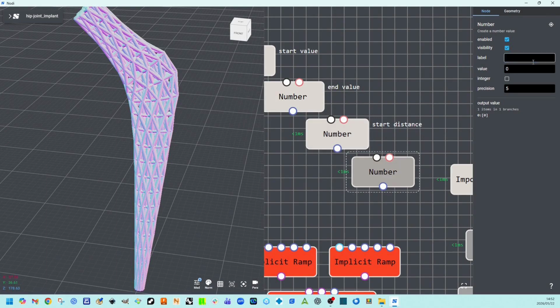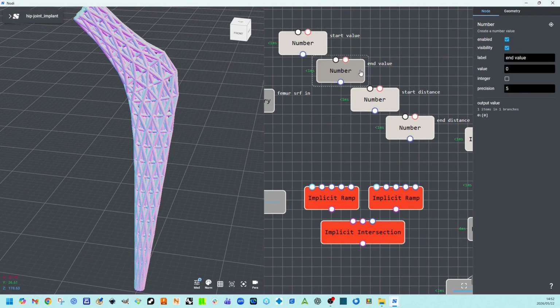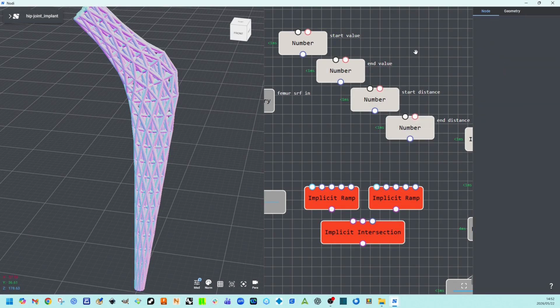To expose the controls, we lay out 4 number nodes and label them start value, end value, start distance, and end distance. We wire them into both ramps. These 4 sliders now drive the entire density gradient.